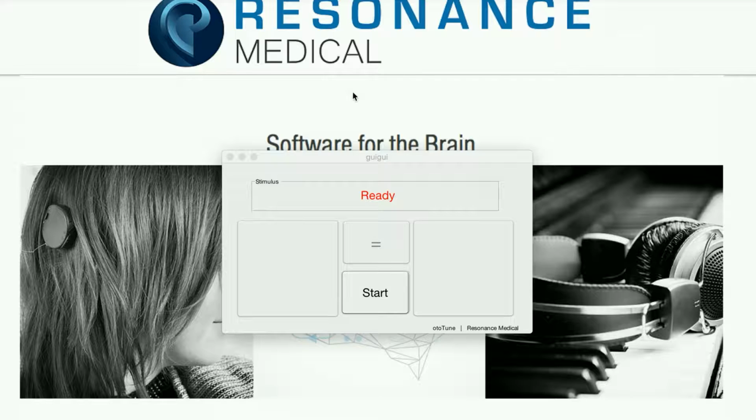This last technique we're using to perform optimization is inspired by a relatively recently formulated problem in machine learning called the dueling bandits problem. And the basic idea is that if you have a large number of parameters drawn, let's say at random from the parameter space, how do you determine which one is best when the only action you can perform are these binary comparisons between pairs of parameters? And so these are what are called duels. And so the idea is that if you take the winner of these duels in aggregate, they should correspond to some statistic that's predictive of a good set of parameters.